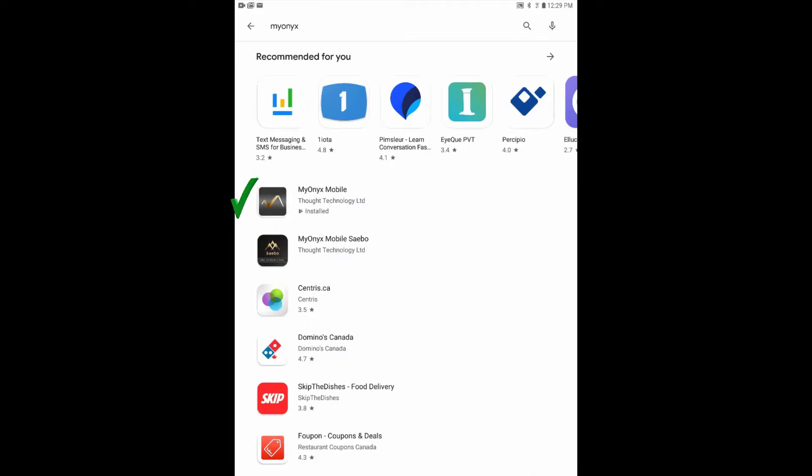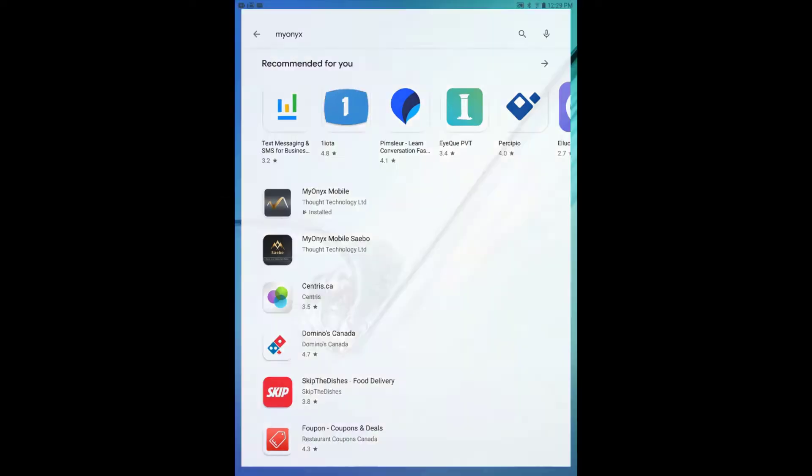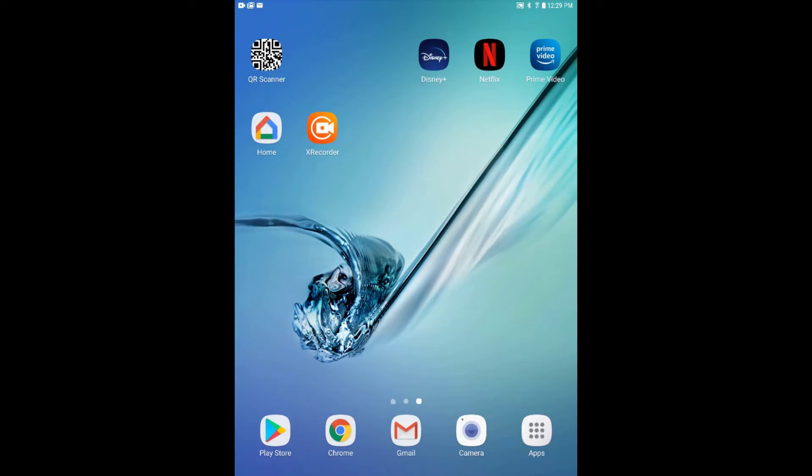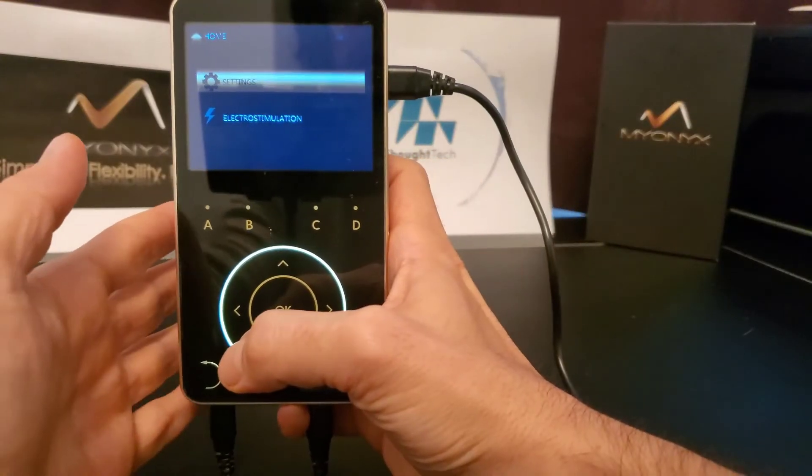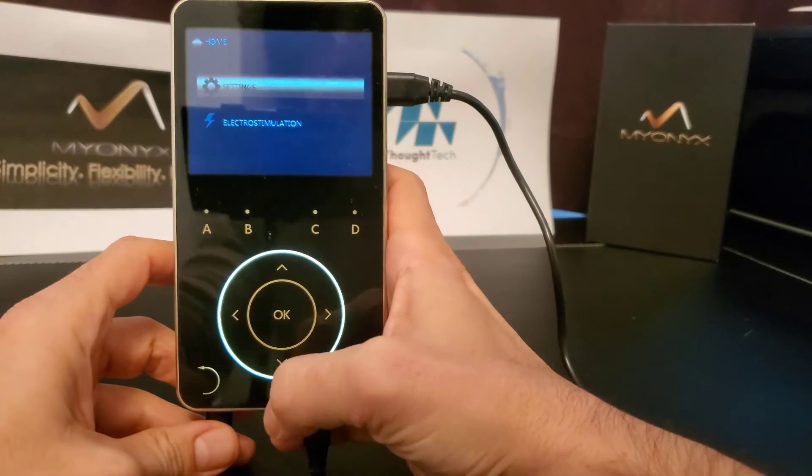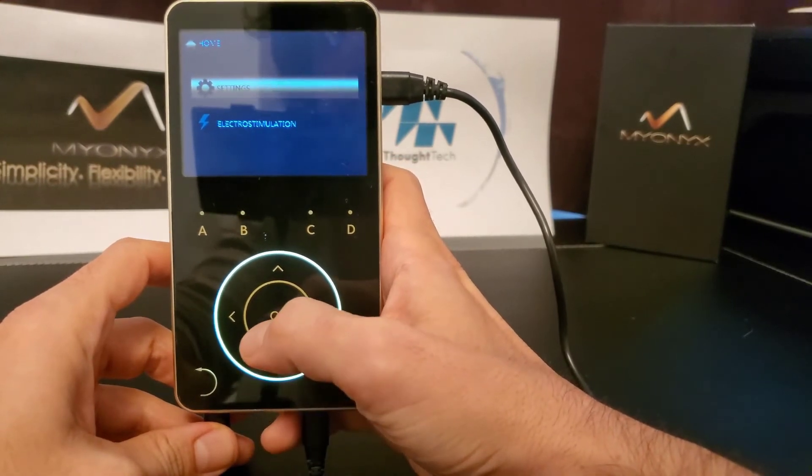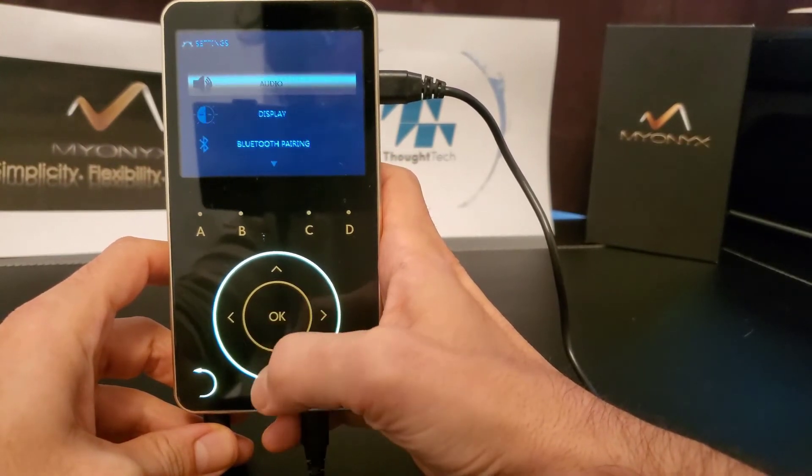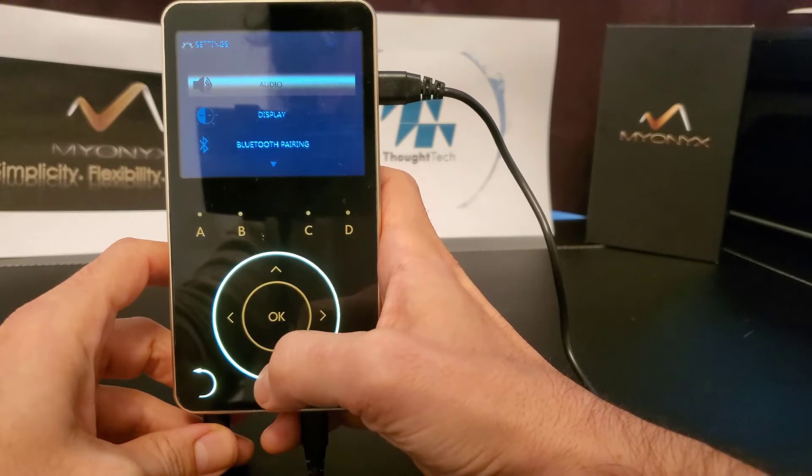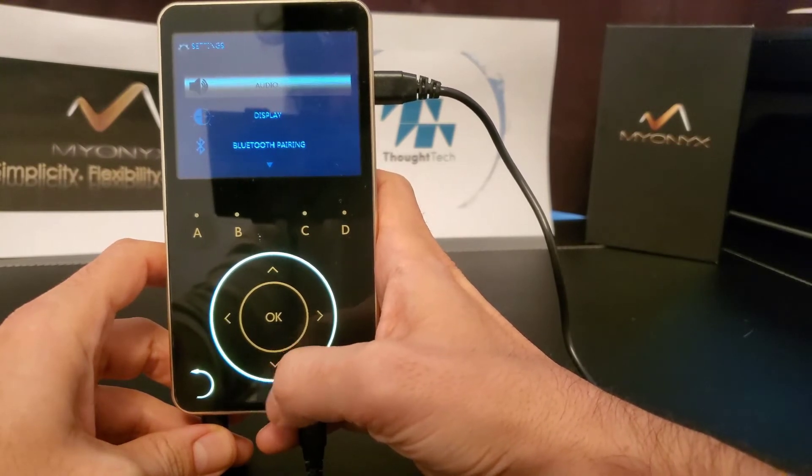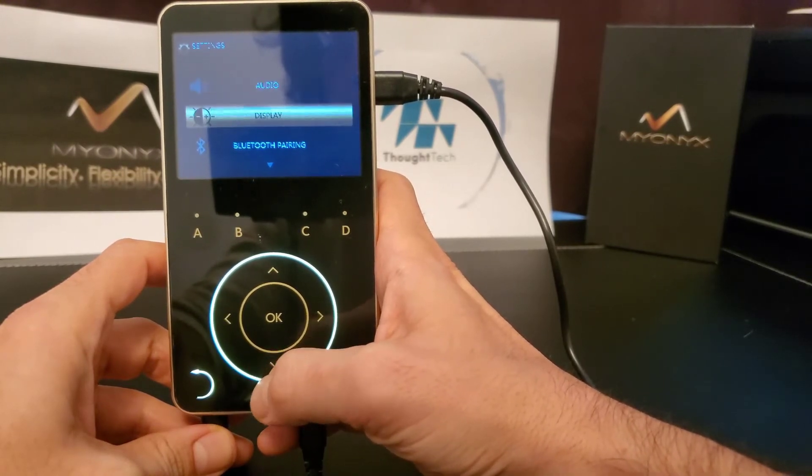To pair your Myonix device to the tablet you would first have to make the device discoverable. To do this on the Myonix device itself, select settings, then scroll down using the arrow keys until you reach Bluetooth pairing. Select by clicking OK.